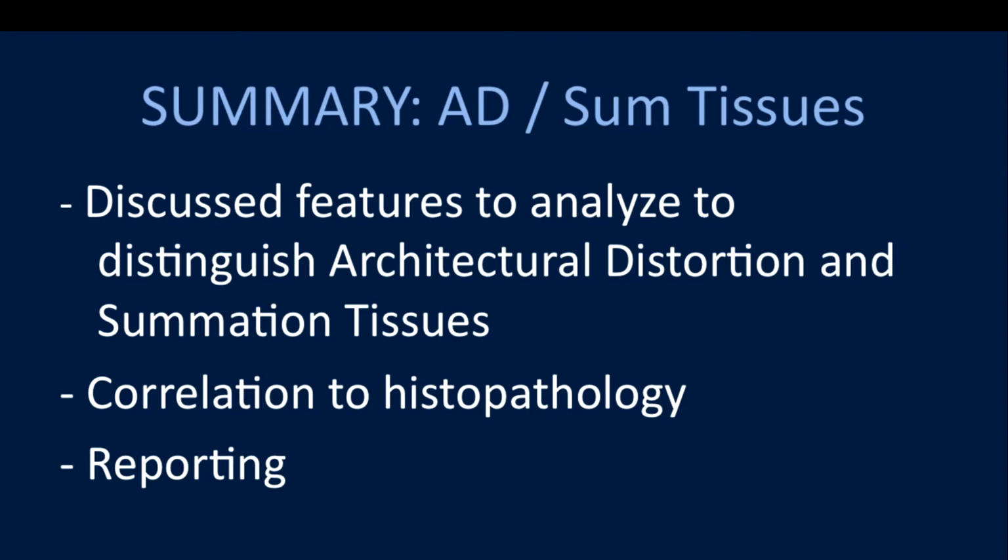So yesterday you saw on the panel, everybody else wanted to do surgical excision. So I think until you look at your own practice, you'll be able to answer that. As with the previous question, if it's summation tissue, then you could theoretically just turn it back to screening. If you still have architectural distortion, but it's truly like one of those cases that I showed, a small 1 centimeter architectural distortion, we don't know.